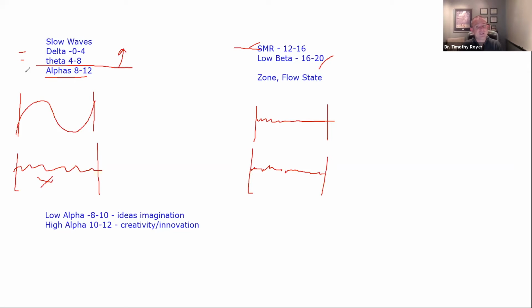And guess what brainwave was discovered first? Would make sense, right? Alpha. The first brainwave that was ever seen on an EEG by Hans Berger was an alpha wave, an 8 to 12 hertz wave. He saw that and identified it on the EEG as alpha. And the second set of brainwaves, the betas, were the second ones. You'll go through them and see that they kind of fall alphabetically in the Greek alphabet.